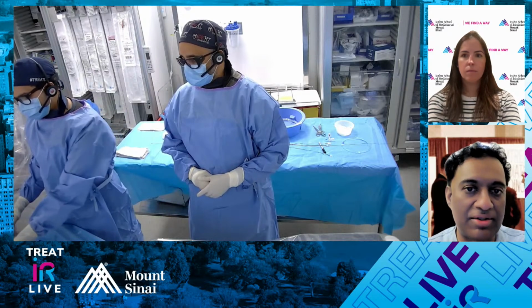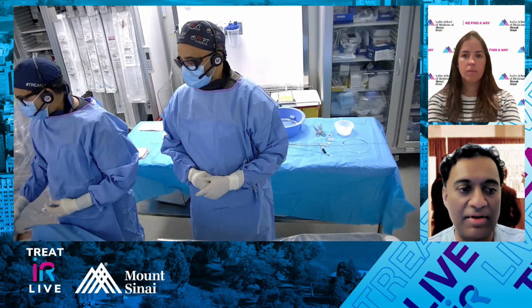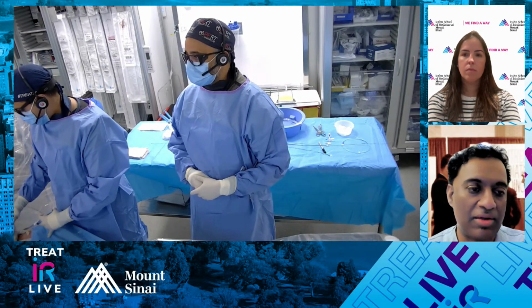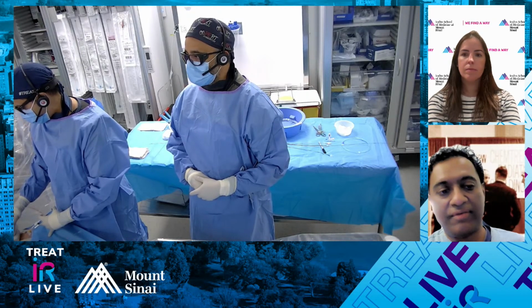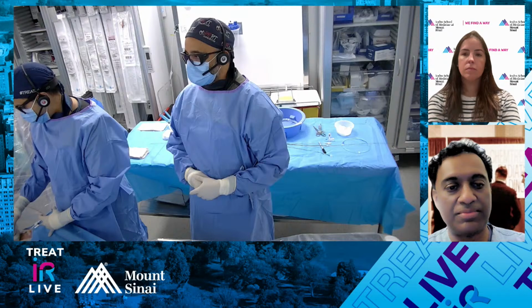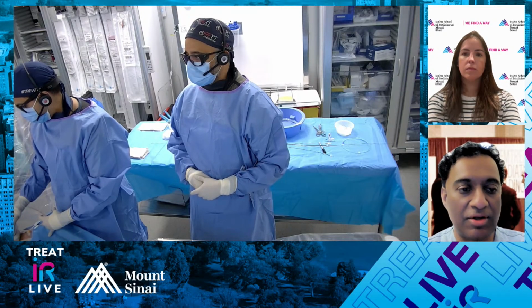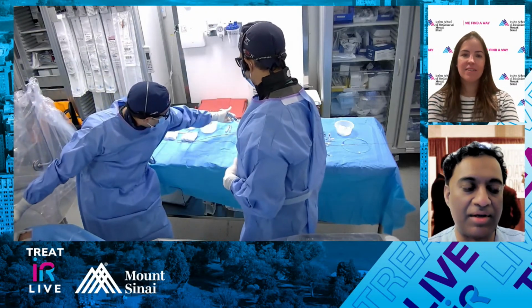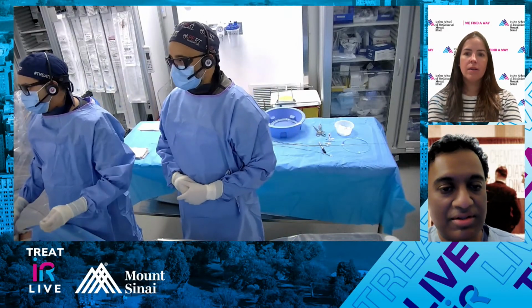They're going to degenerate. Now we have devices both distally, and even proximally, that can fix these paravisceral or thoracic components. So it's good to have new endovascular options instead of open repair for these. It is the bane of endo, but even open repair has degeneration as well. It's not free, so definitely have surveillance.